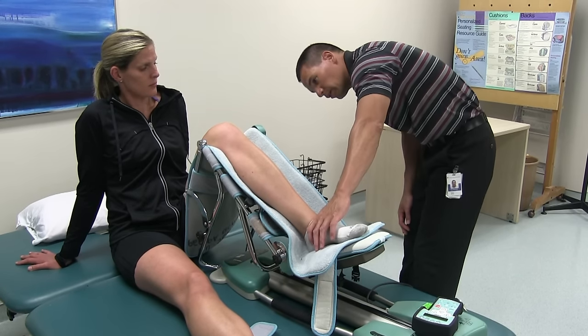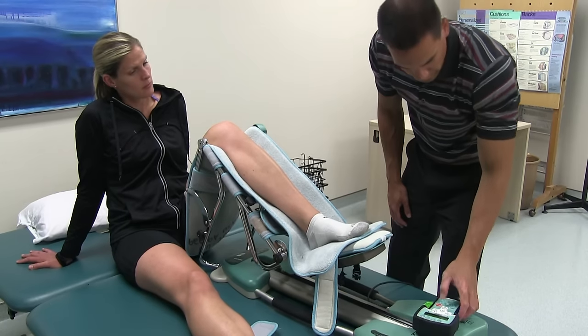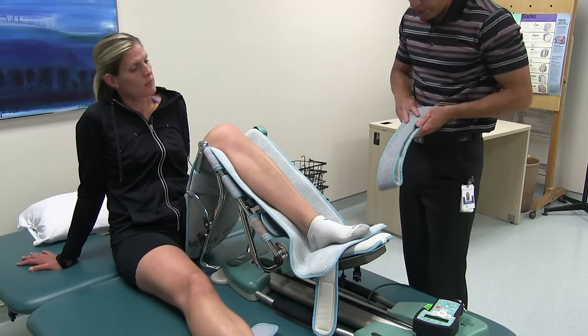The machine is reporting about 110 degrees, which is definitely greater than 90, so that looks good. Once we've confirmed the correct length setting, we want to make sure the patient stays within the machine.